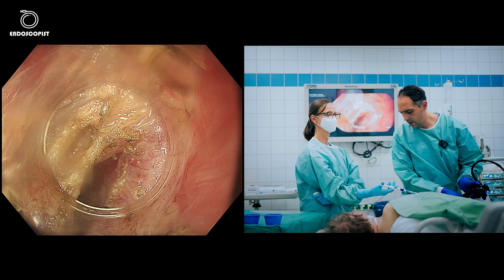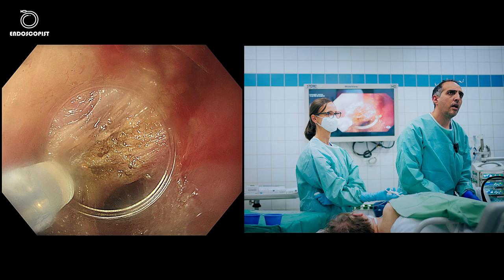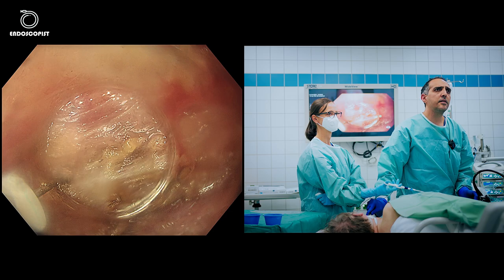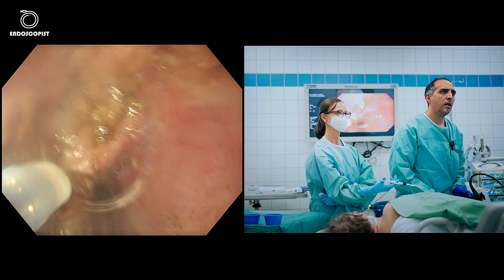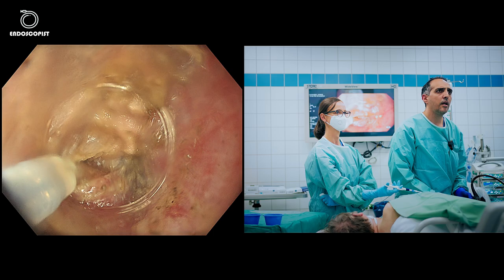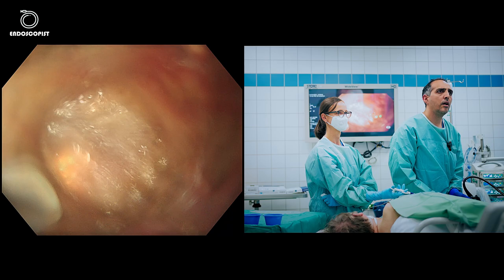I'll hook here again. The beauty of Z-POEM is that you can cut very deep, even opening the mediastinum if needed — that would not be a problem, because you close the tunnel afterward, making it a quite safe technique. I hook on the muscle fibers, stopping before injuring the mucosa, then hook on the other side and cut through. As you can see, the cricopharyngeal muscle is almost completely cut.